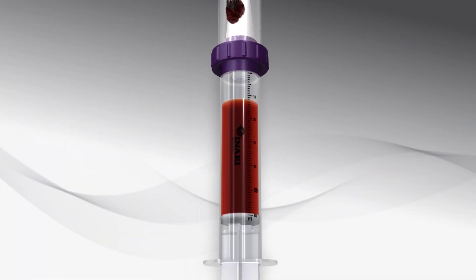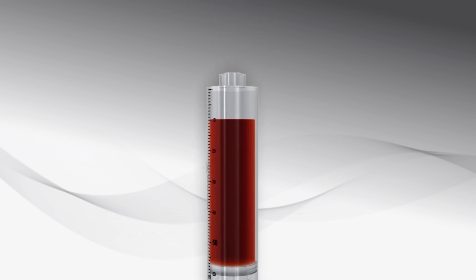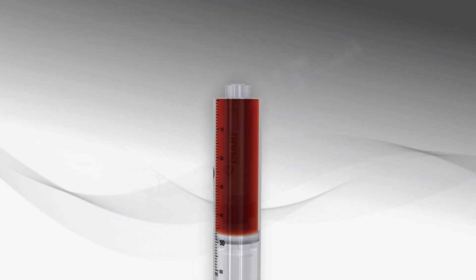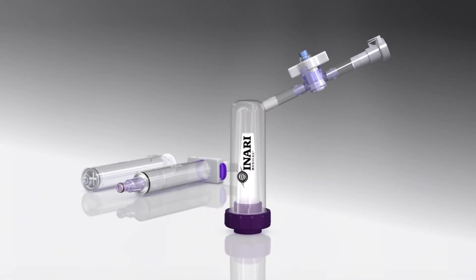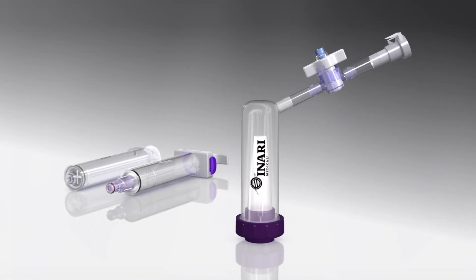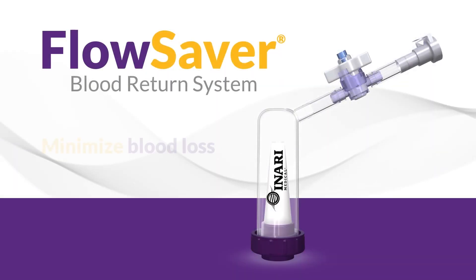Once the 60cc syringe is filled with blood, disconnect from the bottom of the Flow Saver and expel any air. Flow Saver enables physicians to focus on clot extraction and symptom improvement while minimizing concern of blood loss.